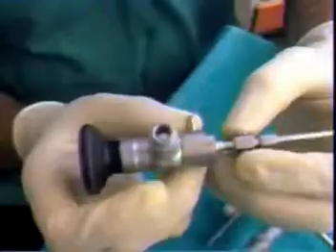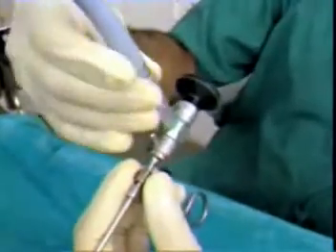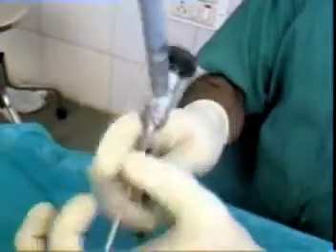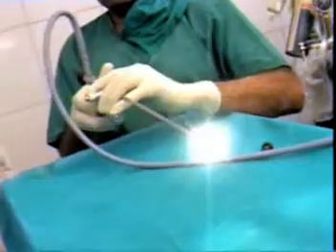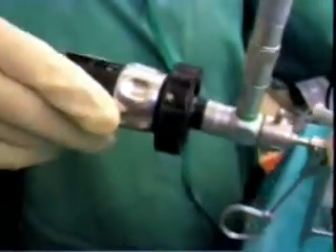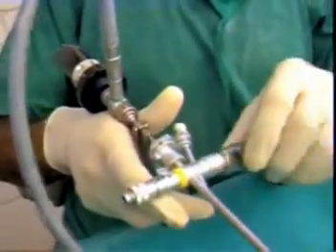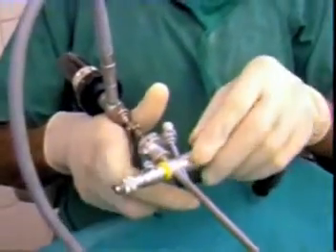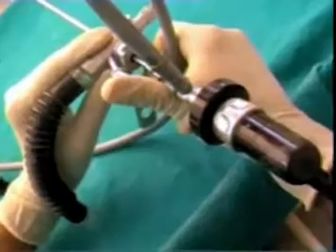The Hopkins bronchotelescope of 2.9 mm diameter is shown along with optical alligator forceps for hard foreign bodies and forceps for soft foreign bodies. This assembly of forceps with the telescope is passed through the bronchoscope. An endo camera is attached to the telescope for viewing on the monitor. Foreign bodies of smaller size are removed through the scope under direct vision.